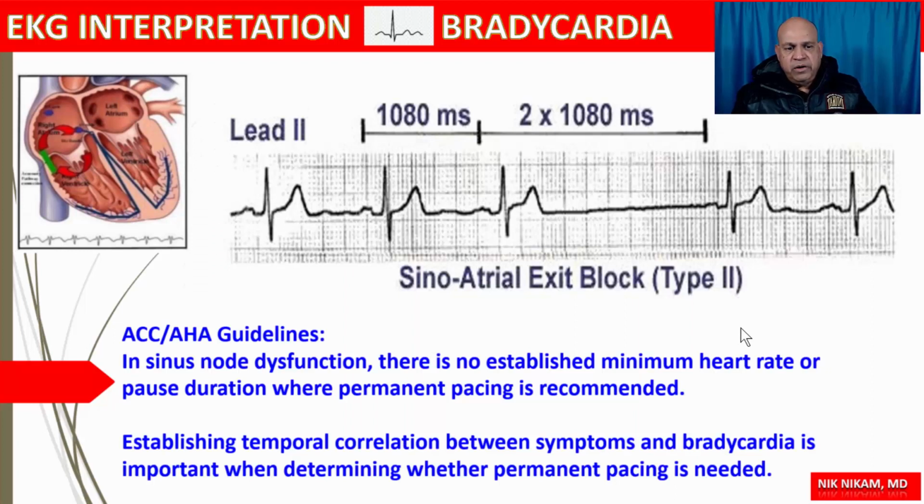All right, let's move on to the next type of sinus arrhythmia, and that is the sinoatrial exit block. At the beginning, I told you about the location of the sinus node. Sinus node spontaneously depolarizes, producing an electrical action potential. That action potential activates the right atrial system through the atrial connections, and thus it activates the contraction of the atria.